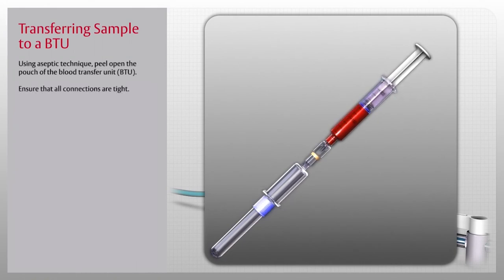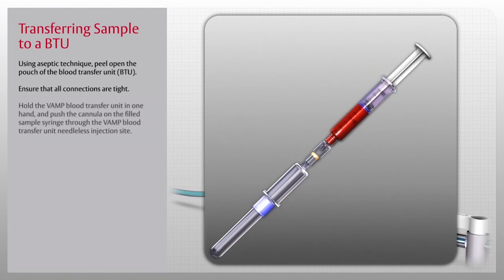Ensure that all connections are tight. Hold the Vamp blood transfer unit in one hand and push the cannula on the filled sample syringe through the Vamp blood transfer unit needleless injection site.